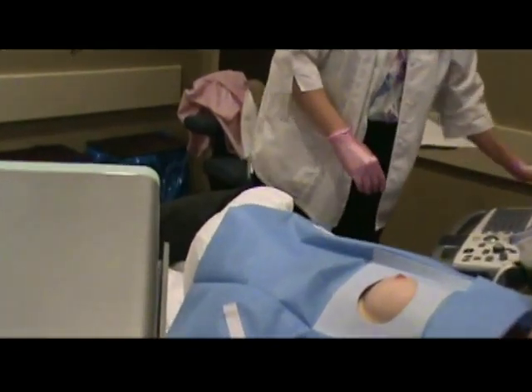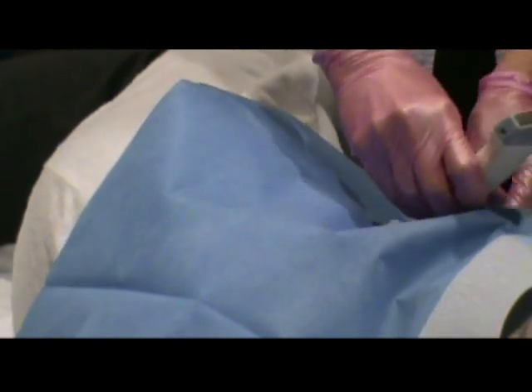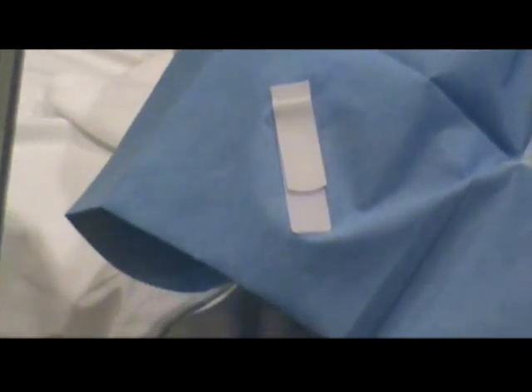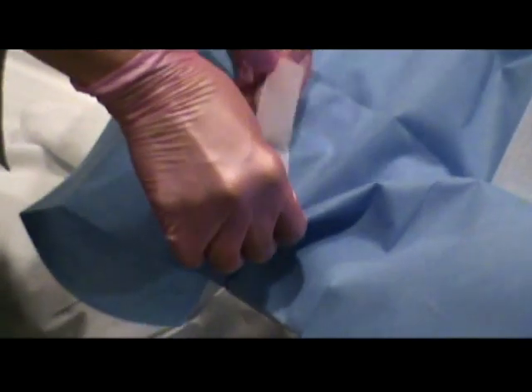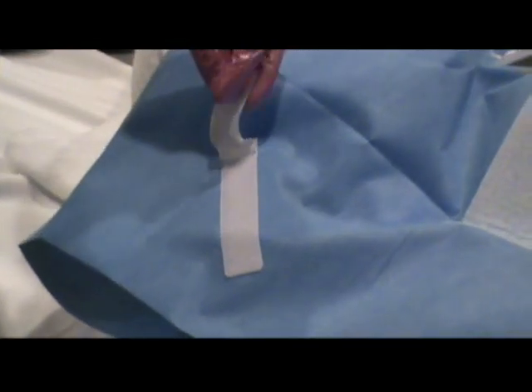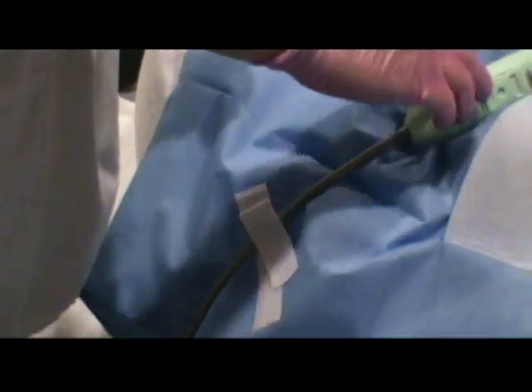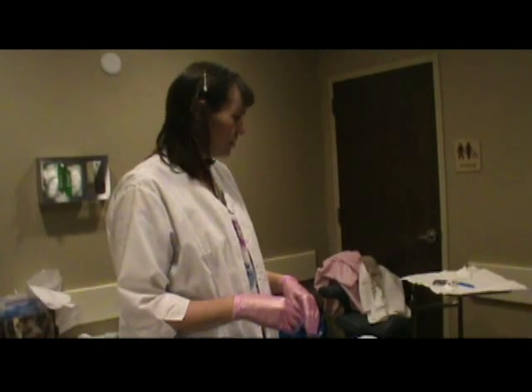We're going to place the probe cord in the first Velcro, and this just allows it to move back and forth but not fall onto the floor. The other Velcro, if you're going to be using a biopsy vacuum-assisted device, this will hold the cord for that. And now you're ready for the doctor to come in and perform the procedure.